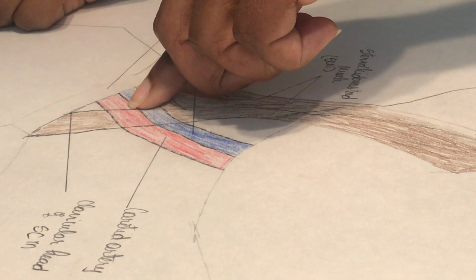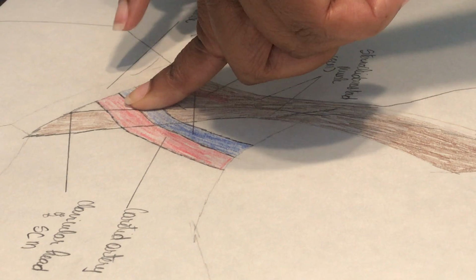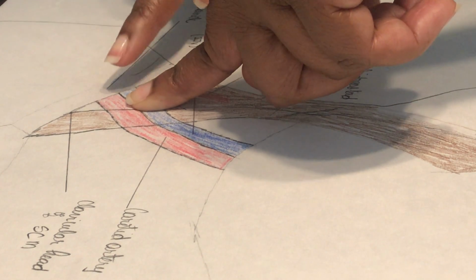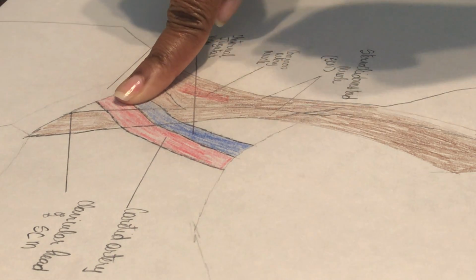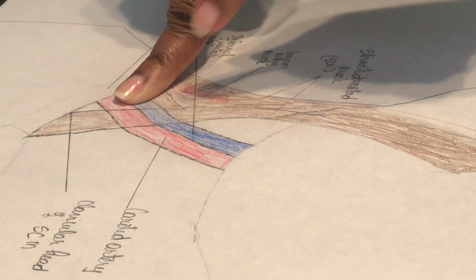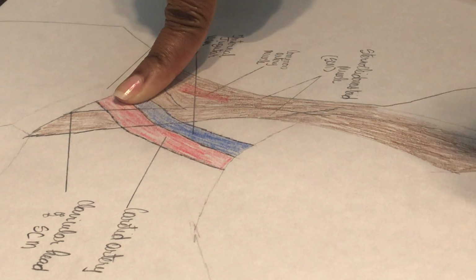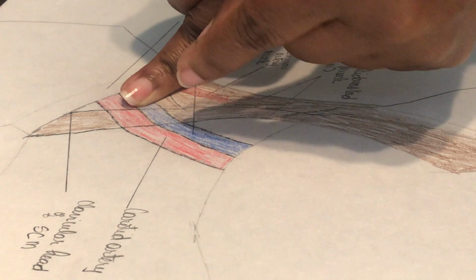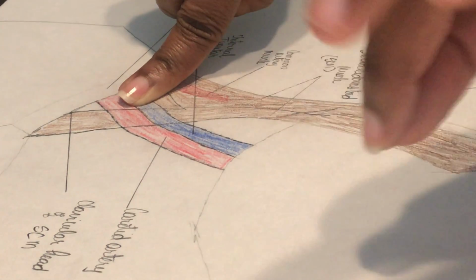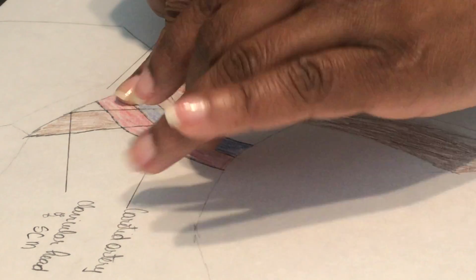We put down our ultrasound machine, making sure that we stay steady on that needle so it doesn't get dislodged. We secure the needle, and then we remove the syringe, and then we make sure that we have continuous blood return. We put the syringe down, we take our guide wire, and then we tilt down that needle at a 15-degree angle. We insert our guide wire while making sure that we're still securing the vessel.